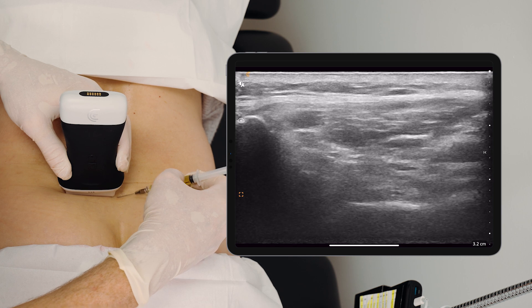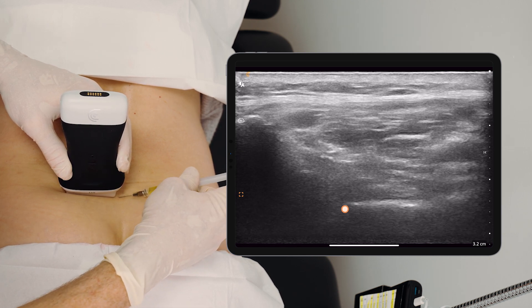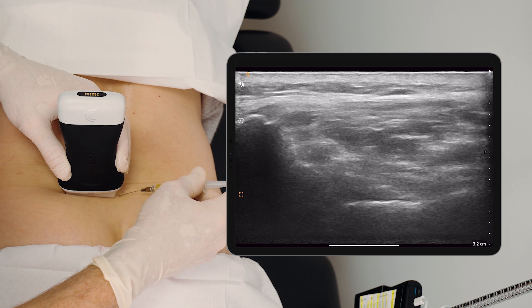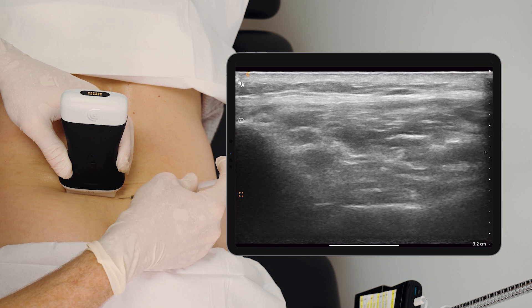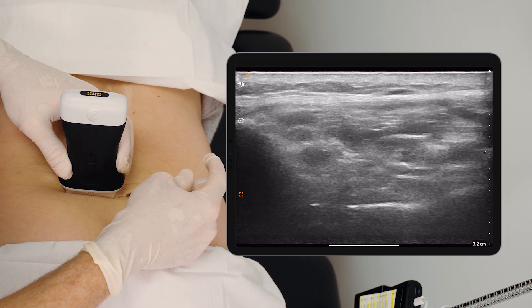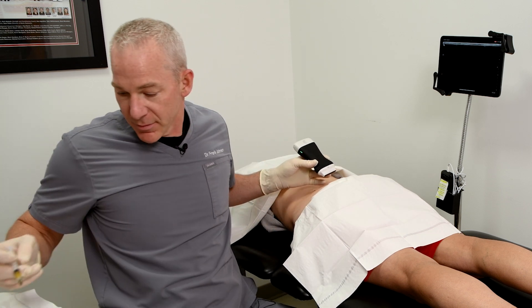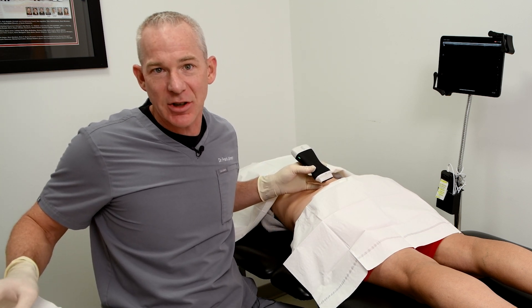I can see my needle trajectory landing into the recesses of the SI joint, deep to the ligaments. And as I inject, I can see the fluid fill up in those ligaments. So that is an intra-articular and intra-ligamentous injection into the SI joint.